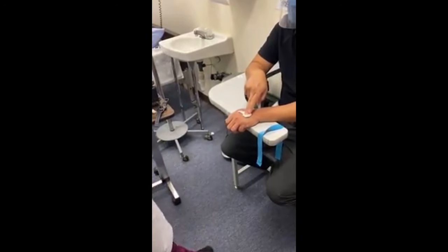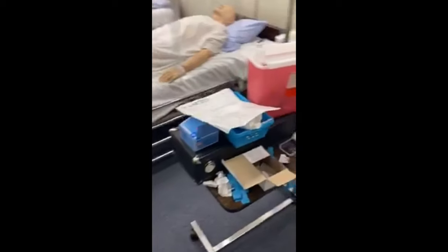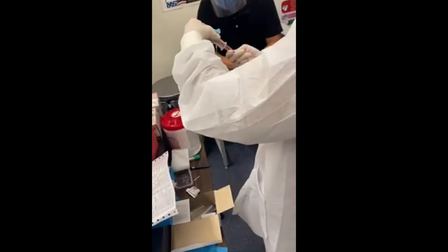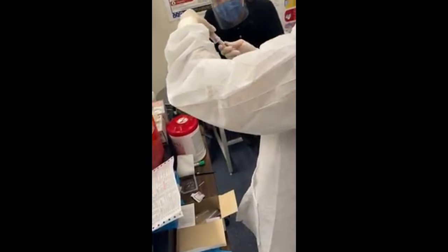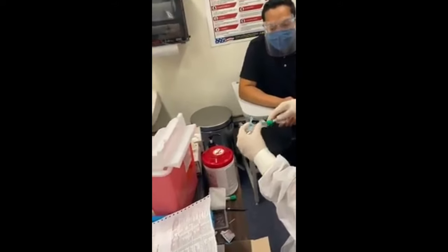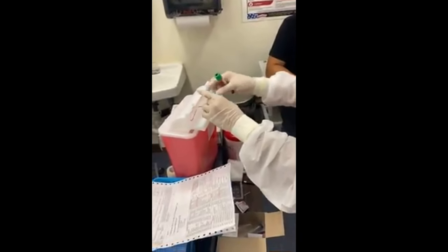Where's the date and time? Okay. Or actually, what you can do is, since it's blood in the line, you could just go ahead and get the rest of the blood from that line there. Was there enough vacuum in there? Oh yeah, you got it. Yeah, there's a little vacuum in there. Okay. Perfect.